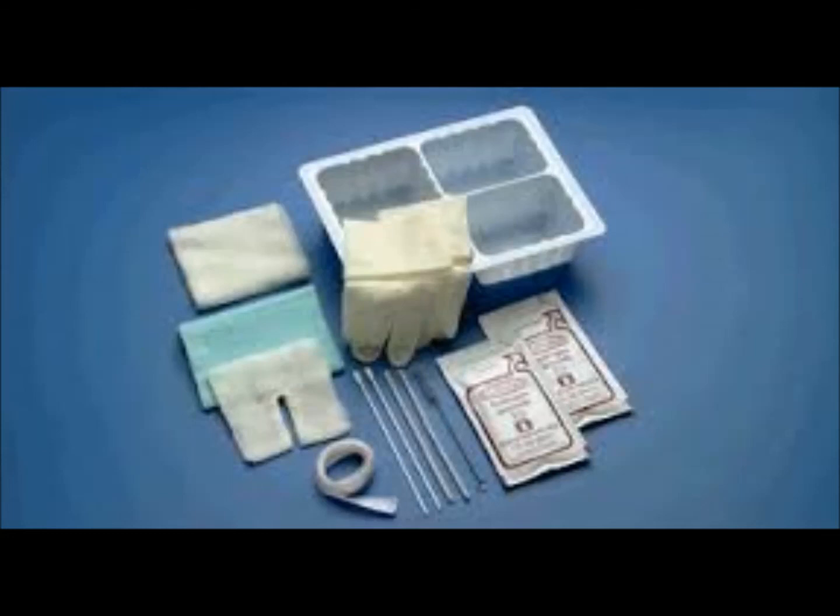Lastly, equipment necessary for cleaning a trach is always good to have at the bedside. Patients with disposable inner cannulas obviously need a box of inner cannulas at the bedside. Non-disposable inner cannulas require the cleaning kit. For all trach patients, normal saline and hydrogen peroxide are necessary for the cleaning process, as well as gauze, cotton tip applicators, and clean trach ties. It is also extremely important to have an extra trach at the bedside.